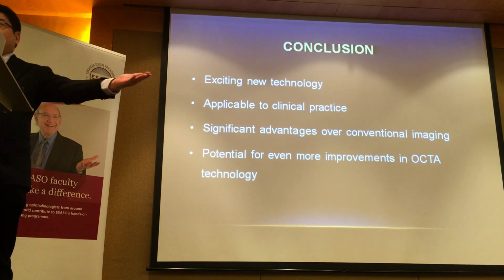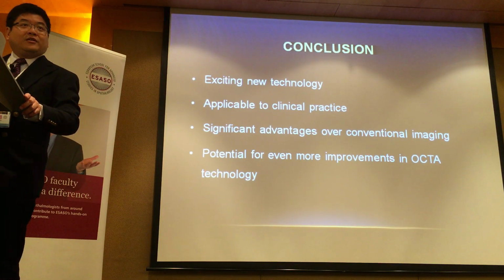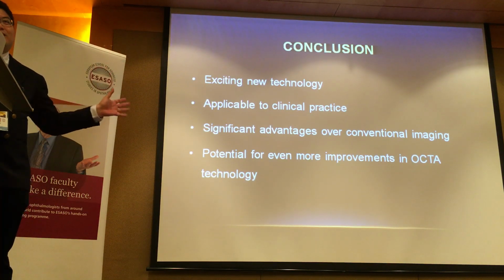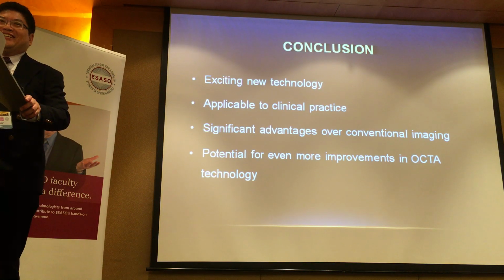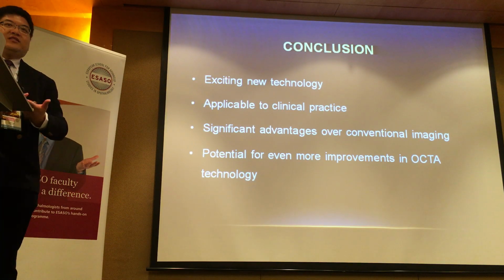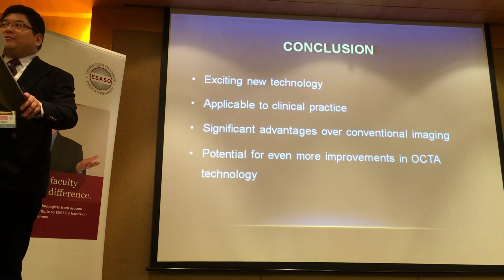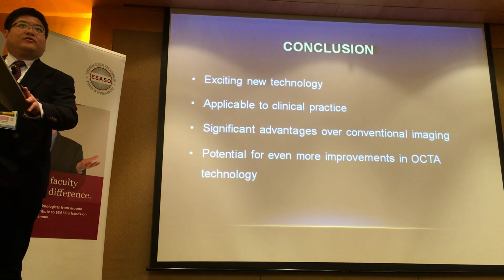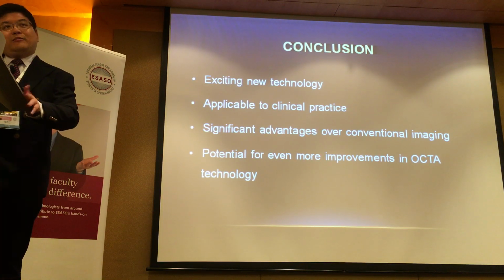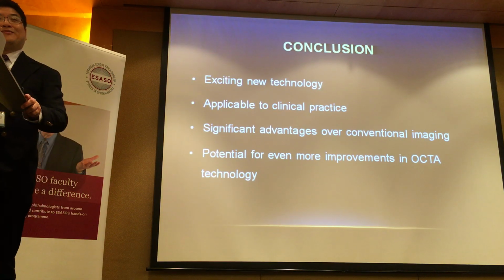If I grabbed one of you and did an OCT-A now, as Adrian mentioned, we did actually have one course where the OCT-A machines were at the side of the room. If we did that and we see something suspicious, what are we going to do? Presumably you're asymptomatic, there's no fluid on OCT, your VA is 6/6. Are we going to treat it anyway? So that's a point. I don't have very good examples here, but I might be popping in over the next few days, even though I'm not scheduled to talk. I'll try to bring some if we can talk over tea or something.